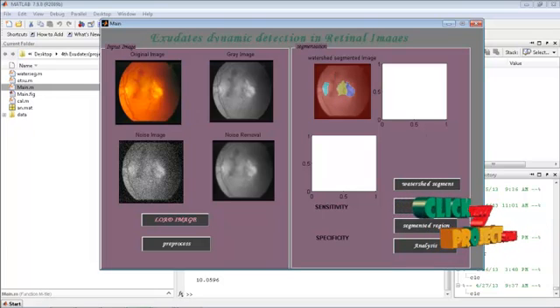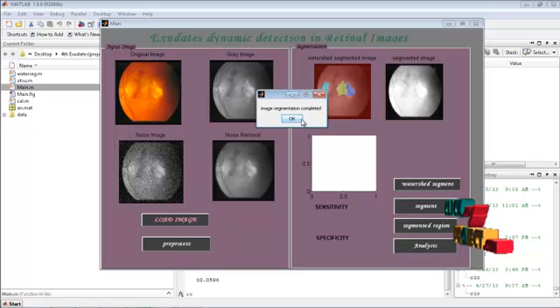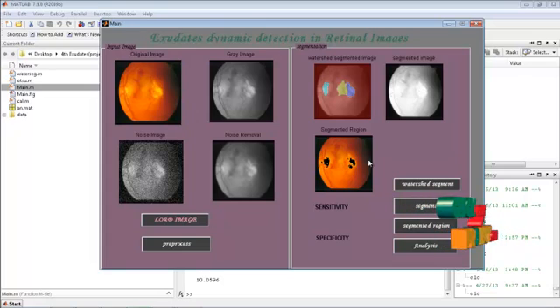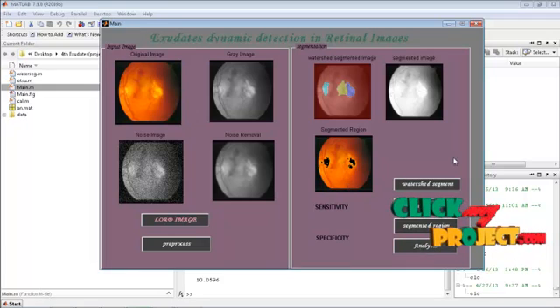The next one is segmentation. Segmentation is completed. The next is segmented region. Segmented region, this is the dynamic detection of the process. Image processing is the watershed segmentation. It gets its name from the manner in which the algorithm segments regions into catchment basins.